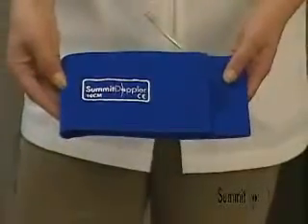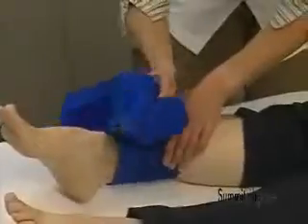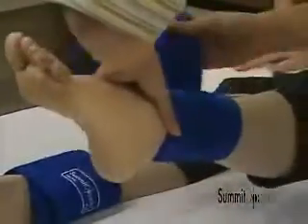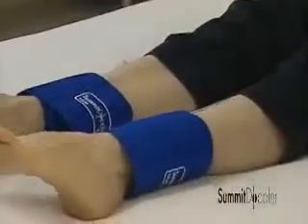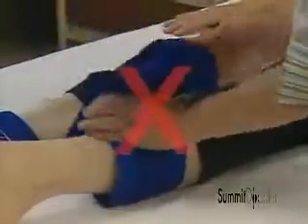The most efficient way to conduct the ABI exam is to wrap all 4 limbs prior to taking the first measurement. This enables you to move quickly from limb to limb and minimize the elapsed time between pressure measurements. A 4-cuff package with aneroid is available as Summit Doppler model number K170. Be sure to avoid rolling up sleeves or pant cuffs in a manner that could obstruct blood flow. Place the cuff 1 to 2 inches above the Doppler site. Avoid placing the cuff too high on the calf, which could result in false, high-pressure readings.